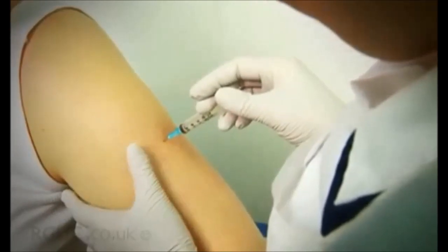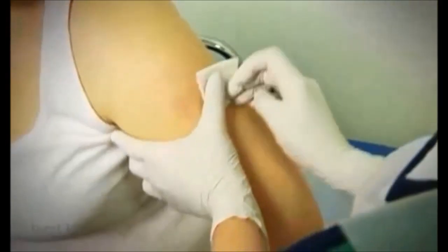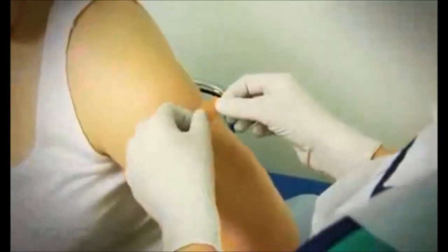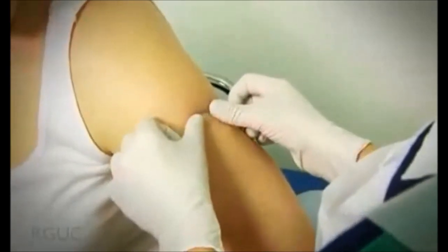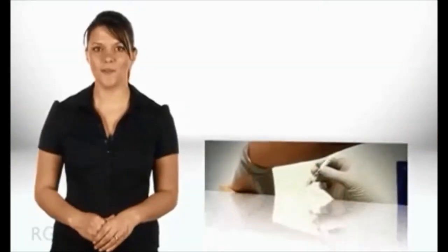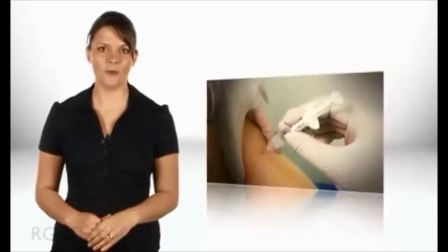Withdraw the needle from the skin and discard the syringe and needle into a sharps bin immediately. Apply gentle pressure over the injection site using gauze. Check the injection site for excessive bleeding or localized skin reaction. Apply a dressing if necessary. Vaccinations are not given using the Z-track technique. The procedure of administering a vaccination is covered in another film in the Tomorrow's Clinician series.